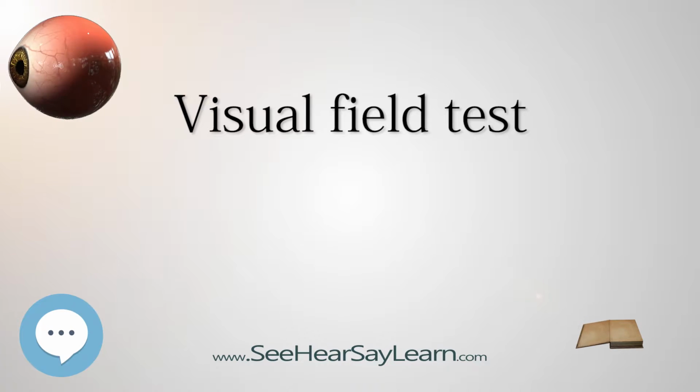Perimetry. Perimetry or campimetry is one way to systematically test the visual field. It is the systematic measurement of differential light sensitivity in the visual field by the detection of the presence of test targets on a defined background. Perimetry more carefully maps and quantifies the visual field, especially at the extreme periphery of the visual field. The name comes from the method of testing the perimeter of the visual field.